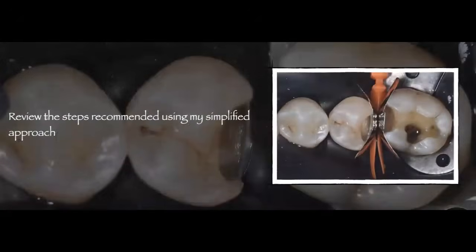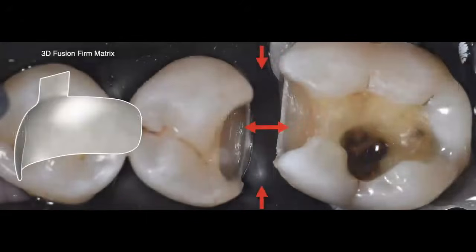So now let's go to objective number 2, and let's review the steps recommended using my simplified approach and also using a fairly new system that's out in the market now called the quad matrix system by Garrison.